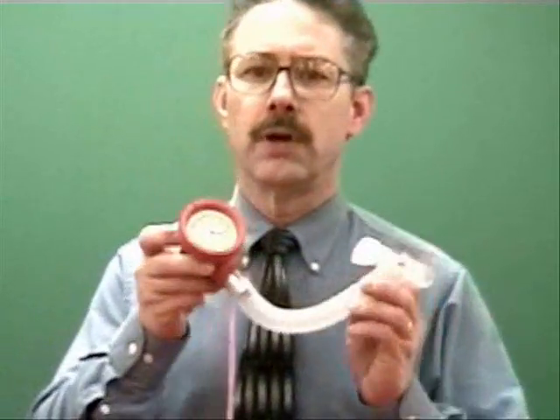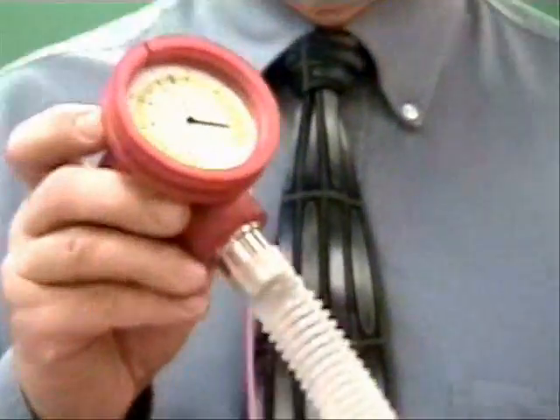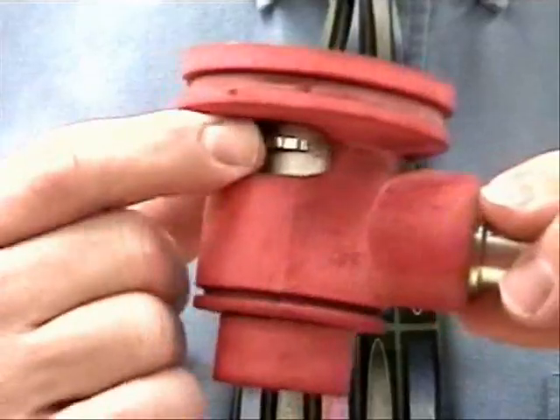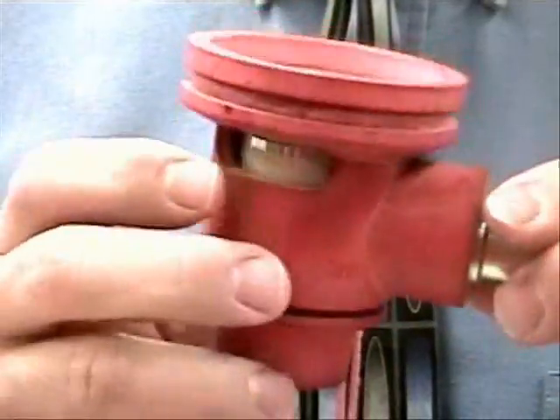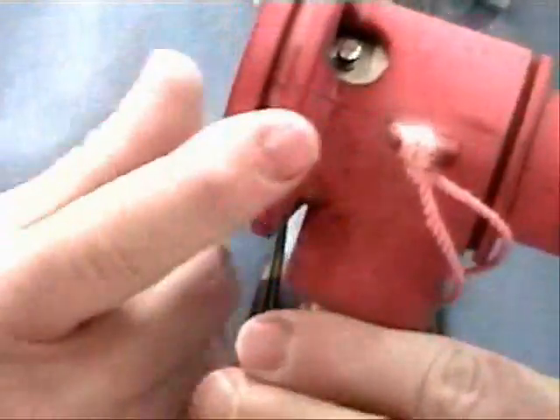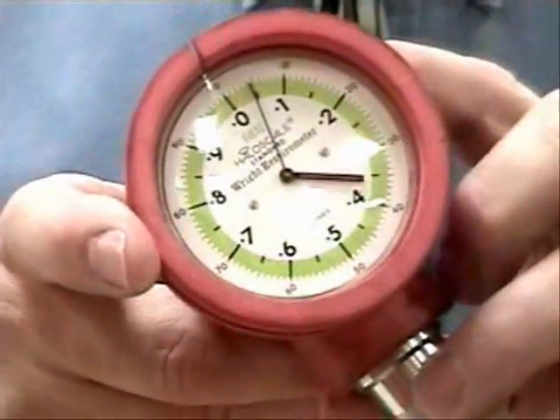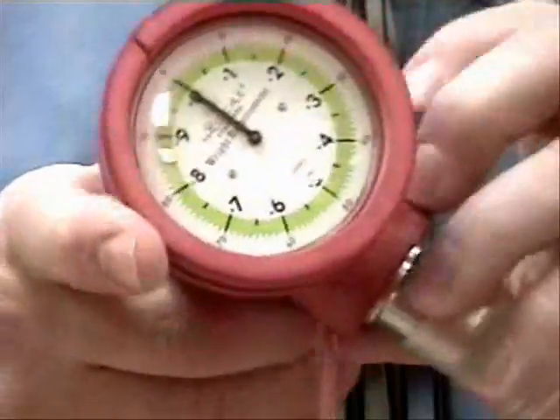Now we're going to talk about the use of a Wrights respirometer for doing tidal volumes and other measurements. This is a Wrights respirometer. It has a couple features. One is an on-off switch. You want to make sure that that switch is in the on position. Also a reset switch over here for resetting everything back to zero, like that.